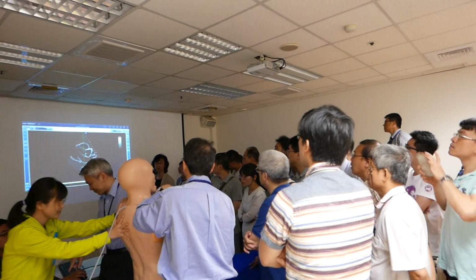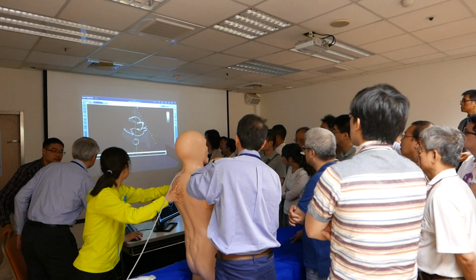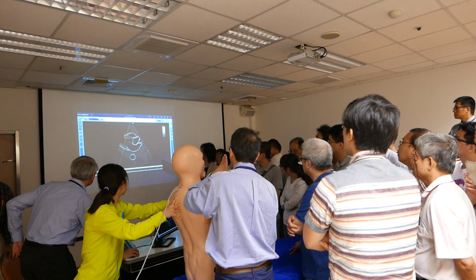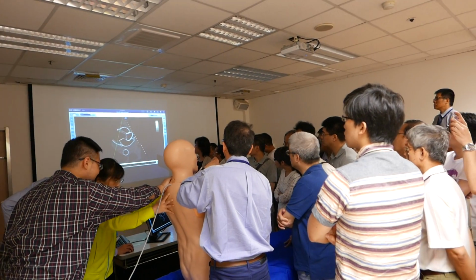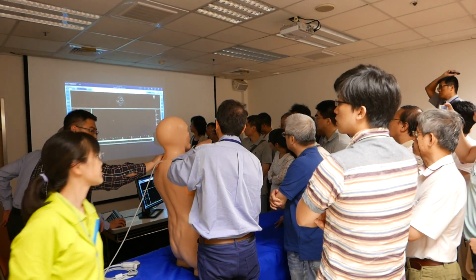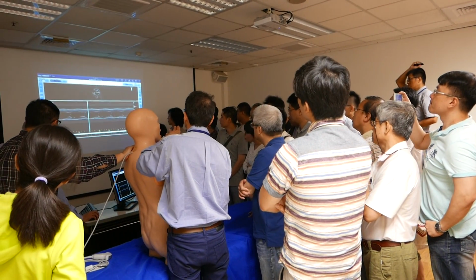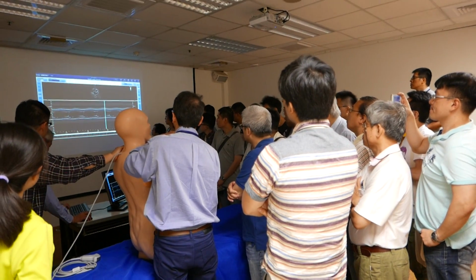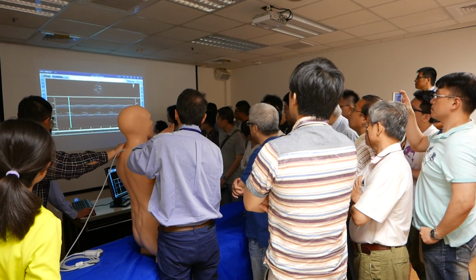Yeah, thank you. So now I need to place the line of the M mode to make the measurement of the left ventricle. Correct, yeah, exactly. So you see we have to place the line orthogonal to the wall and just below the level of the mitral valve. So now we can activate M mode and we can record the motion of the ventricle with time and measure. We can stop the M mode, yeah. And this is where you're going to make your measurement.